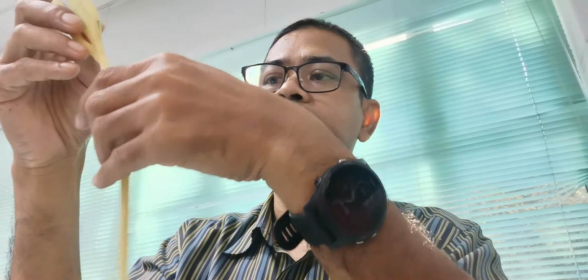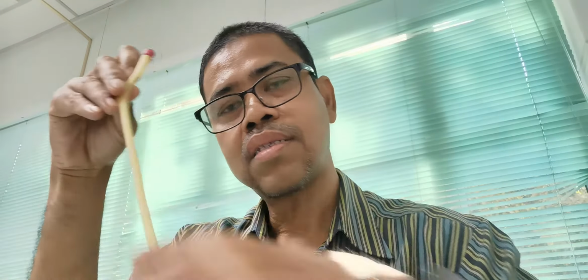Some people cut this end, but the danger if you cut this end is the catheter can just accidentally slide in and then be left in the bladder. Then you need to do some surgical procedure to remove it. So please don't cut this.